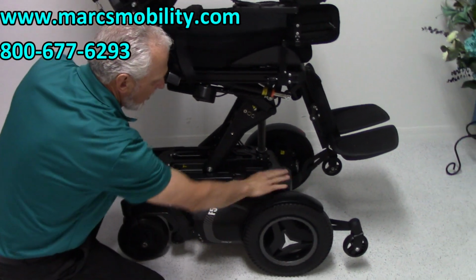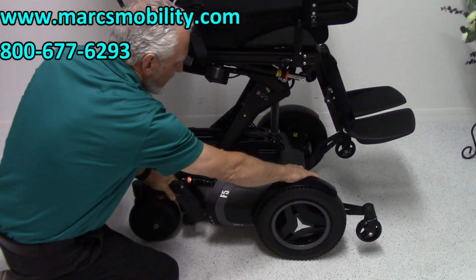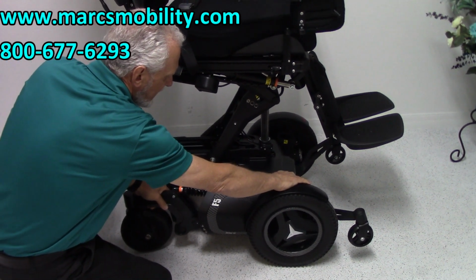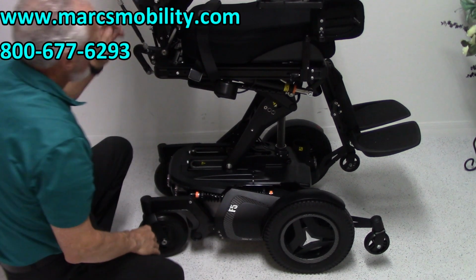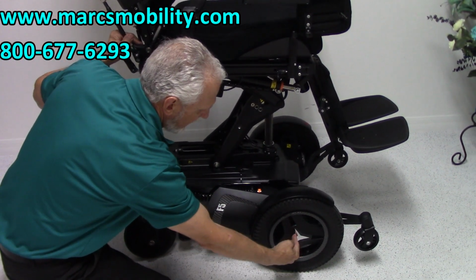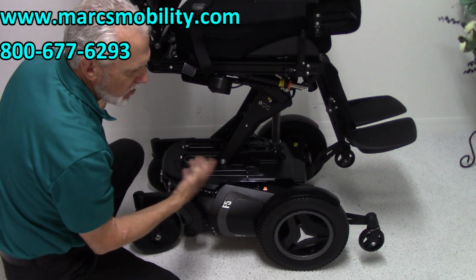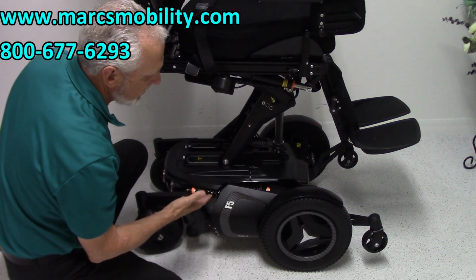You have an anchor point here, and you have another anchor point back here. If you have 2 of them, if you need to tie your chair to your van or to your lift, this is where you would go. There's a motor for each wheel. Each motor goes this way and goes right to the wheel right here. So right now, as you can see, this chair weighs 425 pounds, so we're not going anywhere right now.